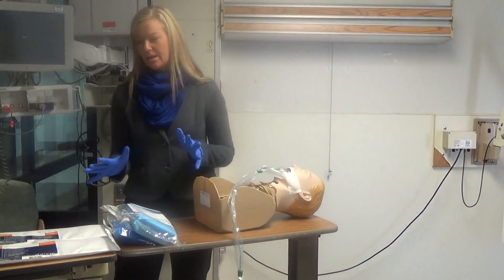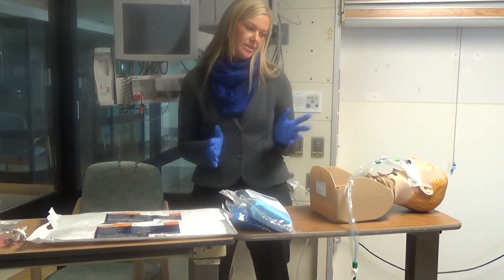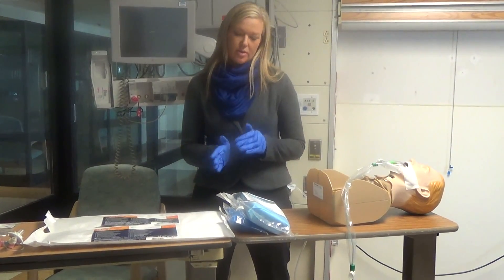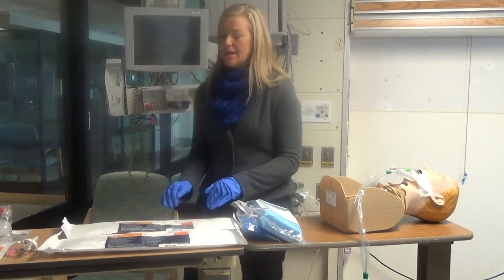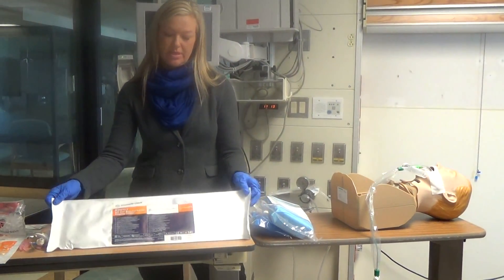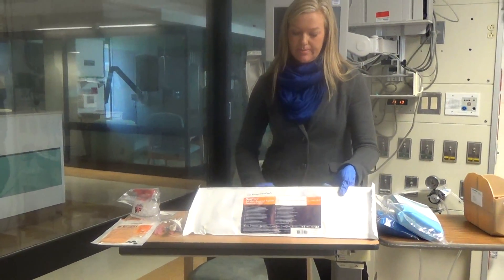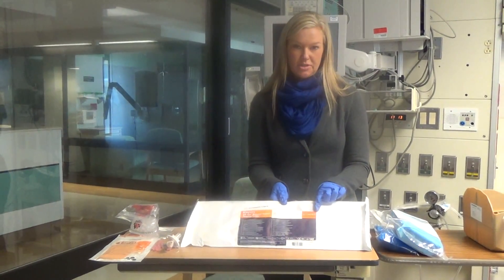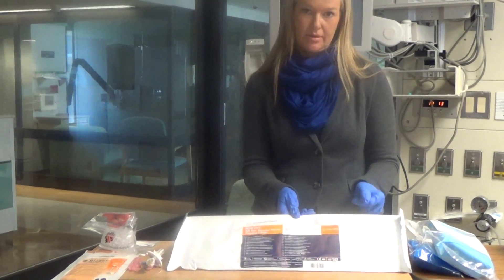I'd like to talk about the products used to do the procedure. You need to determine, based on the size of your patient's ET tube or trach, which of the two sizes of mini-BAL you will need. In most cases, with a 7.0 ET tube or larger, you're going to use item number 142, which has slightly larger packaging. This is a 16 French outer diameter with a 12 French inner diameter catheter — it is a catheter within a catheter.